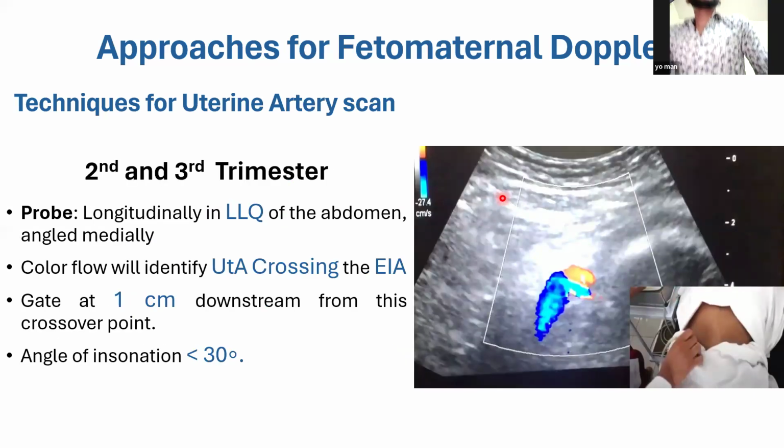Nice. As I told you before, measuring uterine artery Doppler in the first trimester differs from the second and third trimester. In the second and third trimester it's not that important, because it's the early period that is really important. In the second and third trimester, the other use is to identify IUGR apart from preeclampsia.